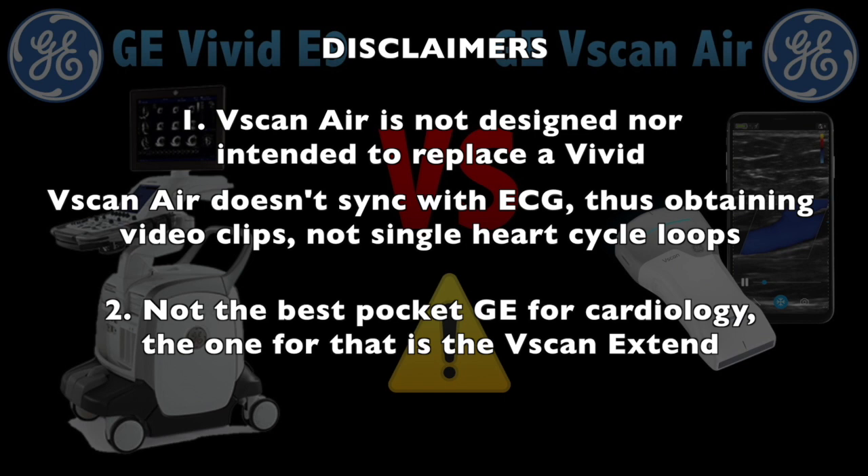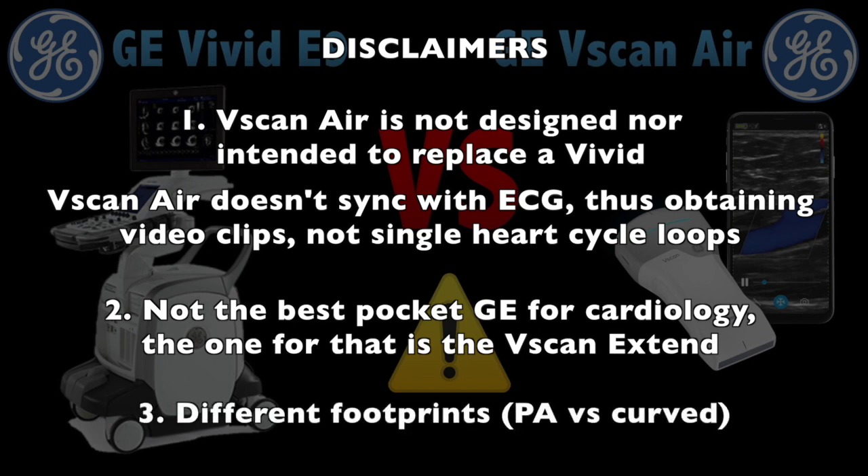Number two, it's not even the best device for cardiac exam that GE has — that one is the Viscan Extend, which is optimized for cardiology. And finally, number three, the footprint is different, with the Viscan Air's footprint being very wide, and thus making it difficult to obtain some apical four chambers.